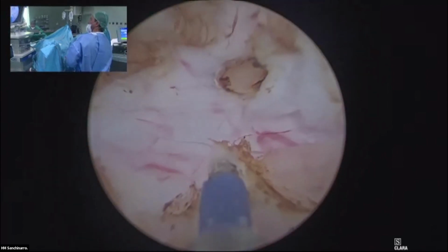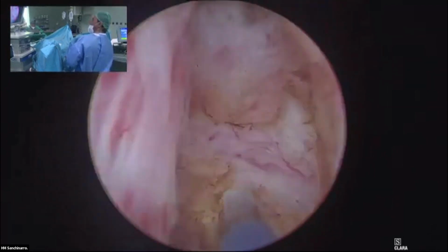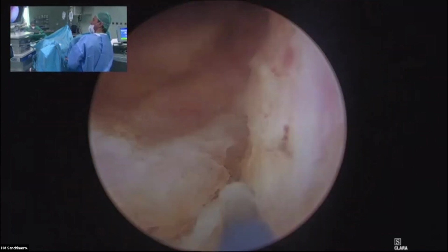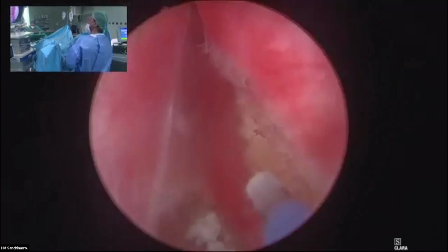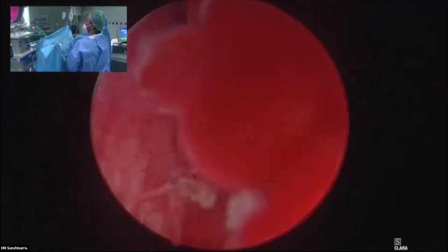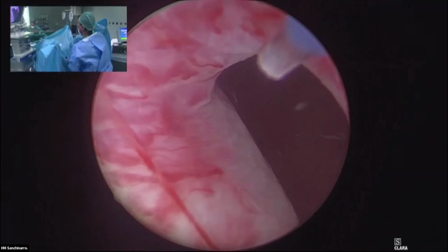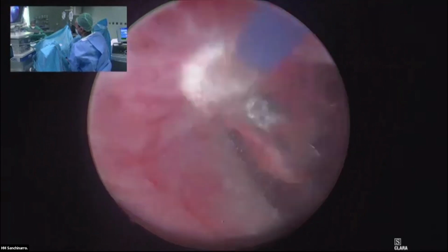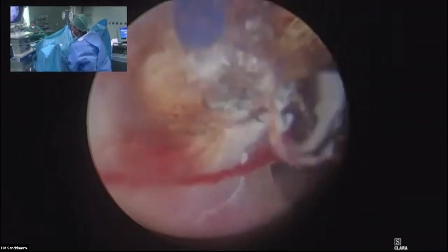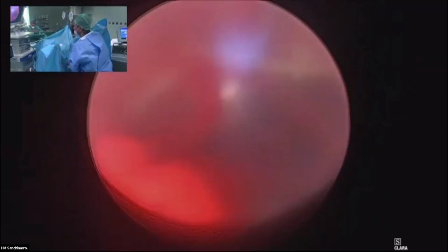So a little bit of coagulation on the capsule. And now we have 6 o'clock done. We have a good separation in between the two lobes. And here we have the bladder neck. Now what I do is I go upstairs at 12 o'clock to make a first little separation on the commissure in between the two lobes. I really work attached to the bladder neck with the same zigzag movement that you saw before at 5 and 7 o'clock.